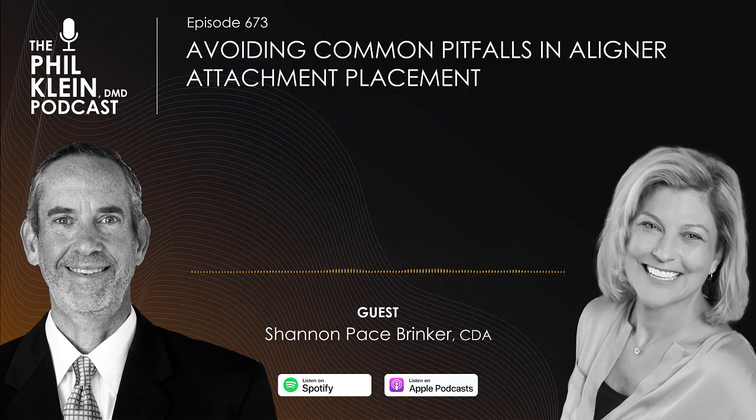The other thing is that we want to make sure that template is sacred. I mean, it is sacred. It's like the Holy Grail. We cannot let the patient go home with it. We've got to save it. And most importantly, we need isolation first.